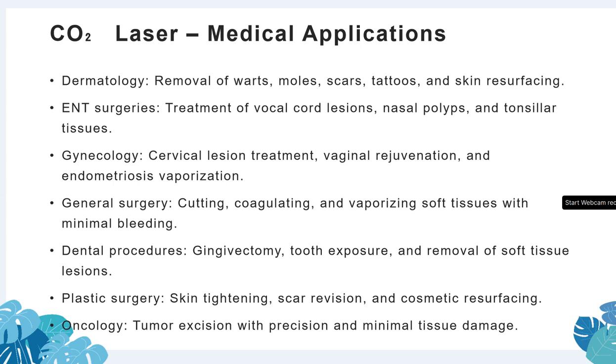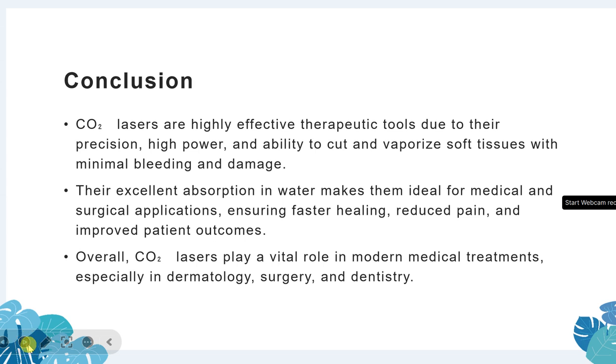Dental procedures: gingivectomy, tooth exposure and removal of soft tissue lesions. Plastic surgery: skin tightening, scar revisions. Then let me move to the next slide.